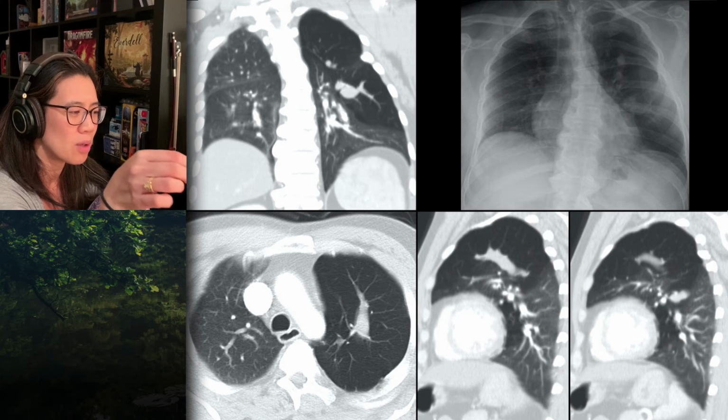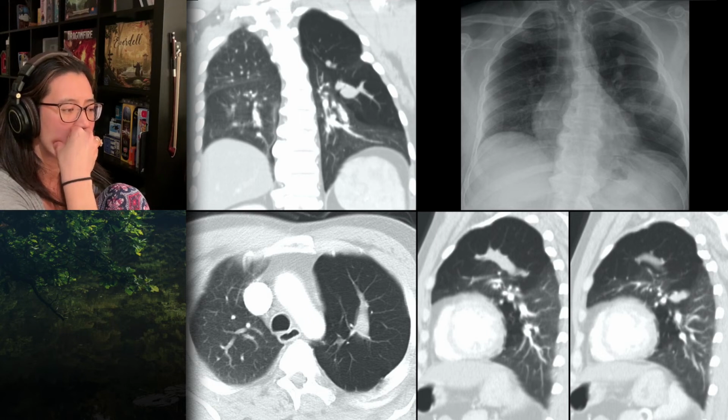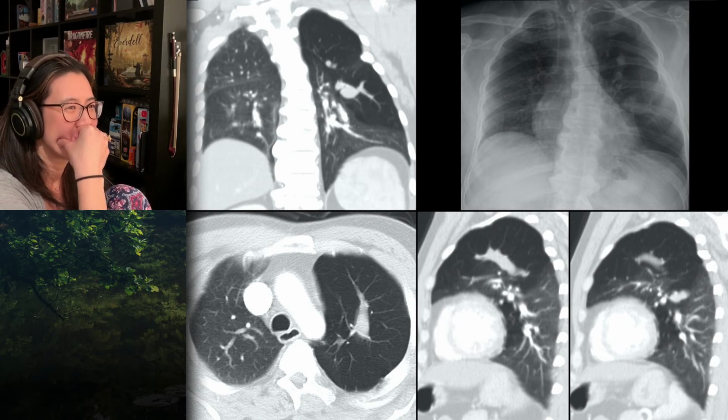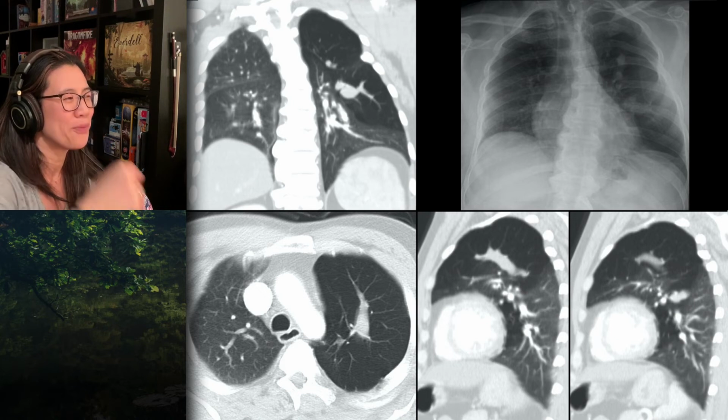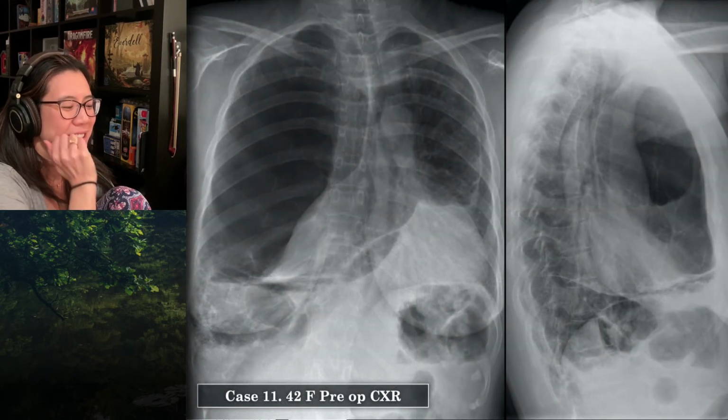Benign and malignant causes of bronchial strictures resulting in bronchocele. They can be congenital as well, I think. Yep, bronchial atresia. That's probably the most likely. This is just a congenital bronchial atresia, except I don't know what those funny deformed ribs are all about. So maybe the patient had something in the past as a child that I know nothing about. Yeah, so you're right. There's something blocking the bronchus, which might be congenital, and this is a typical appearance of a bronchial atresia. But it may also be a bronchial stricture from some previous surgery or from some other pathology we don't know anything about. Excellent. So they're bronchoceles and hyperlucent lung. Nice. All right.